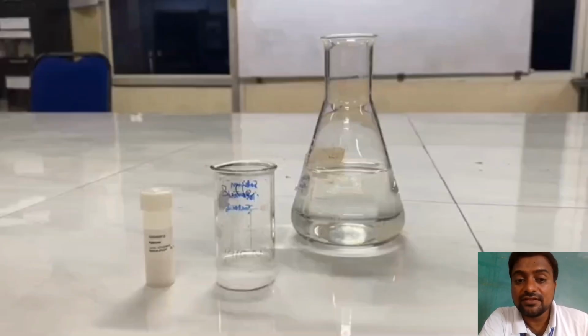This is the reason the name of the experiment is single radial immunodiffusion. That is, the antigen diffuses through the gel in a circular fashion, as there is antibody present in the gel as well.